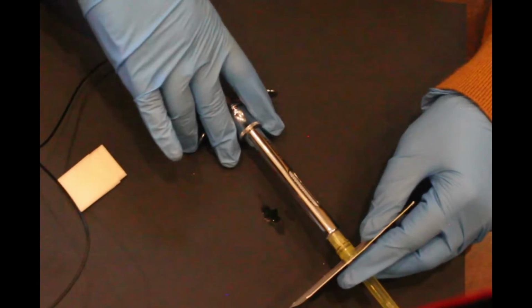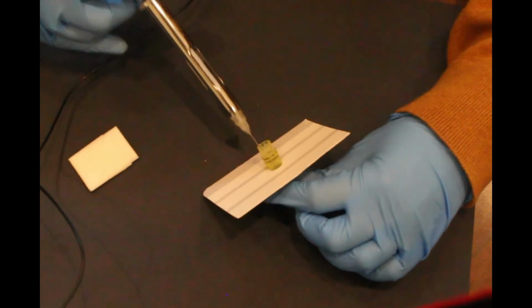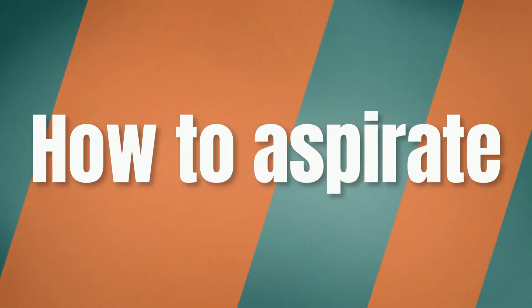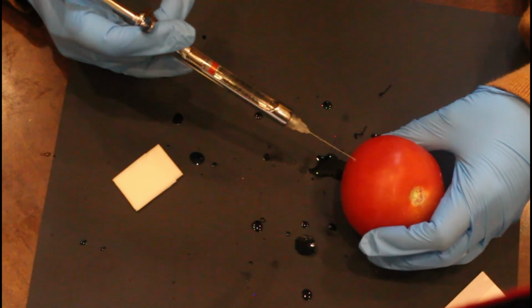With the use of the protector sheet, you hold on to the long part of the needle cap and just pull it out to drag the needle. How to use the self-aspirating syringe in the mouth. In this example, a tomato is being used as a mouth.